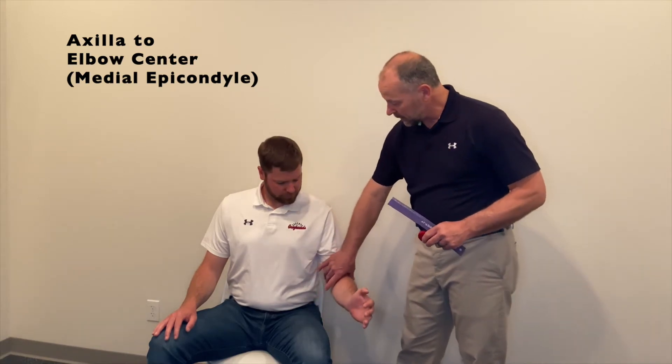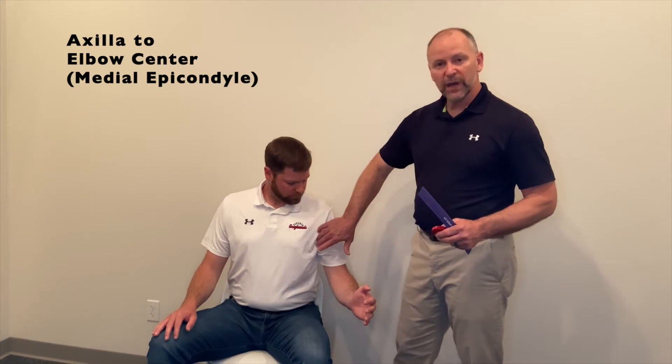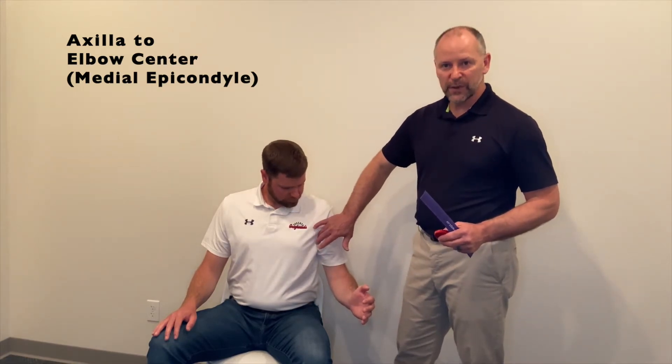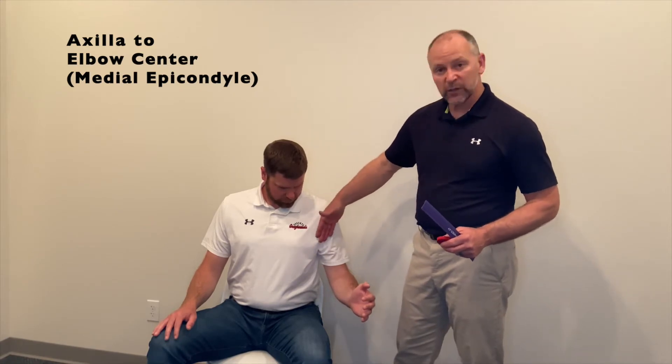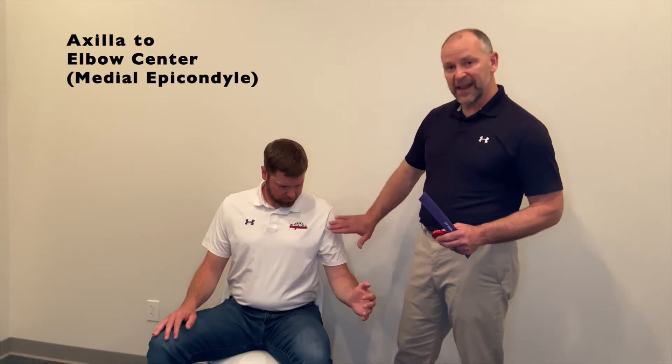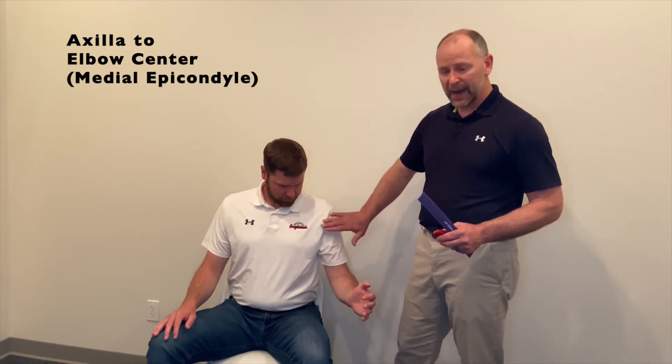The first measurement we're going to capture on the upper arm will be from the axilla to the elbow center, which we represent as the medial epicondyle. It's very important that we determine an appropriate starting point for this measurement proximally. That's going to be the axilla, and we define that as where the pectoral musculature meets the biceps musculature on the anterior surface of the body.